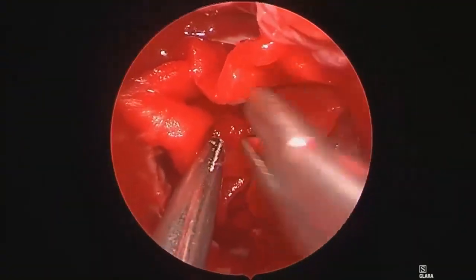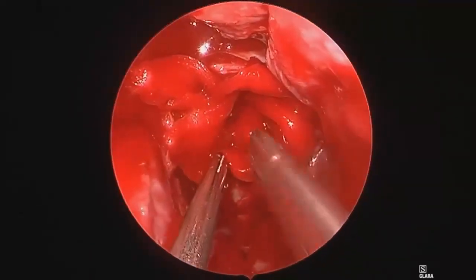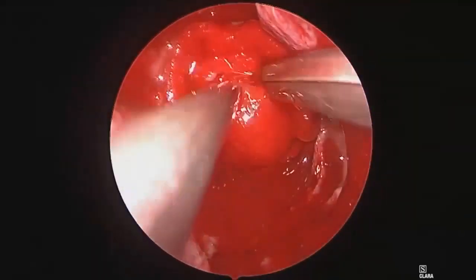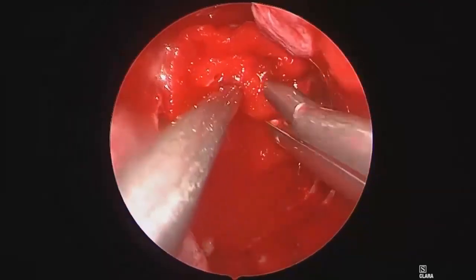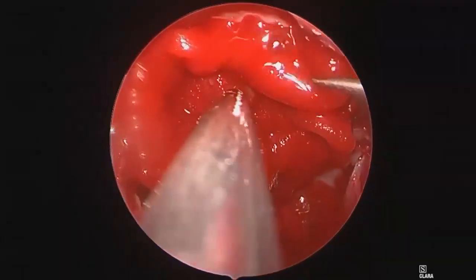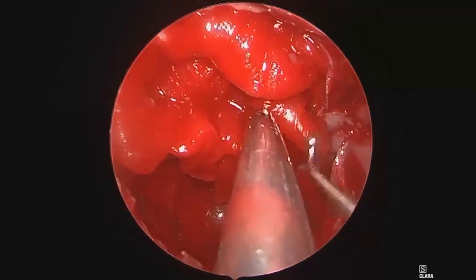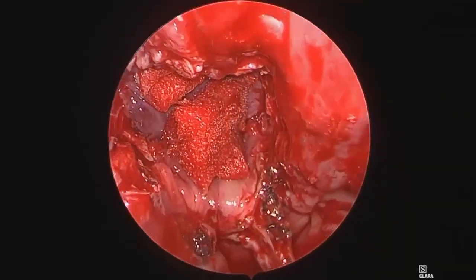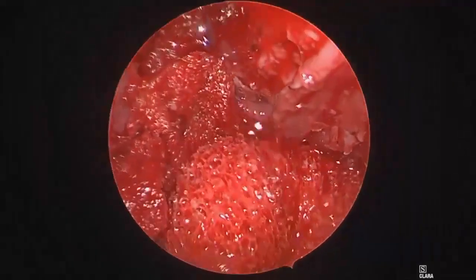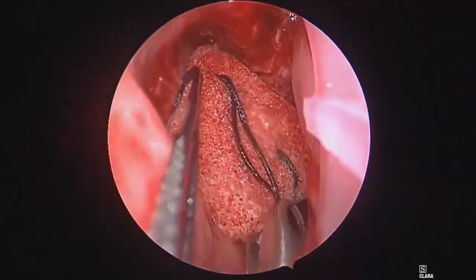The surgical cavity is finally irrigated, and a DuraGen inlay is used to reconstruct the dural opening. The DuraGen inlay is placed in a gasket seal type fashion to allow for good apposition to the dural opening. The nasal septal flap is the final layer of closure. This is a pedicled vascular flap that is elevated off the septum and then rotated to oppose the bony opening of the skull base.